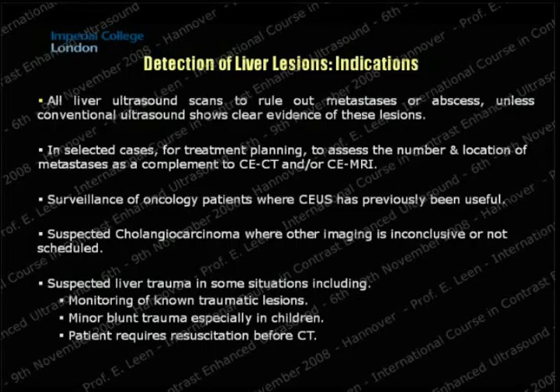So I think it's fairly legitimate to actually use contrast in this kind of circumstance. The next one, which is interesting in the sense that, in children, although none of the agents is actually licensed for use in pediatric care, one will have to request local ethics acceptance in using contrast in children in the first place. But I think it would be wise, given that you don't want any radiation in children, using CEUS would be appropriate with the help of your ethics committee.